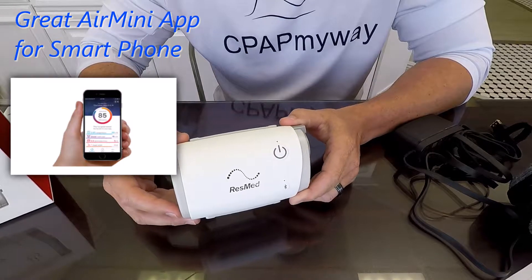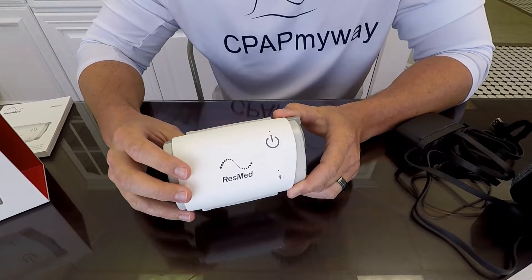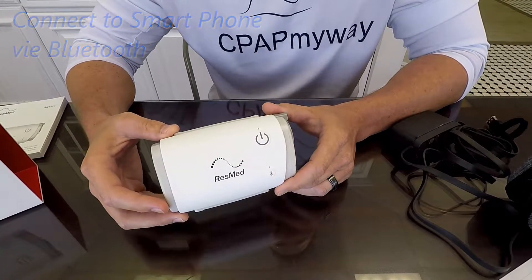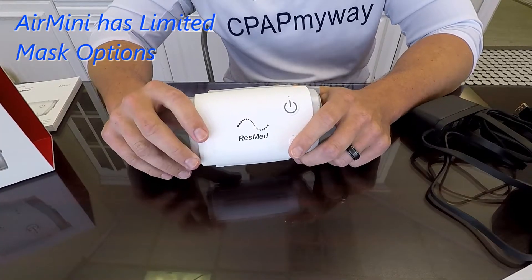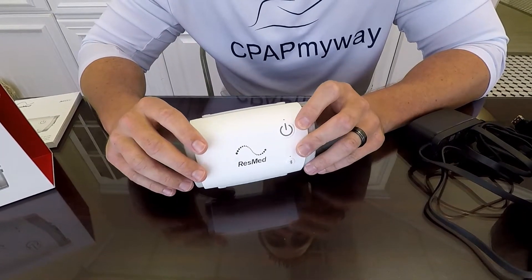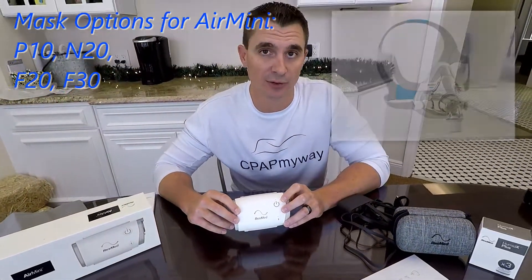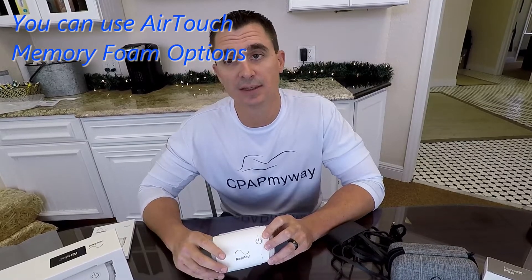It also has a really nice app, the Air Mini app — not to be confused with the My Air app. The Air Mini app is specific to the Air Mini and does a really good job of sending your daily reports and will Bluetooth to your unit for direct connectivity. The cons are the mask limitations. You can only use one of four ResMed masks: the P10, the N20, the F20, or the F30. That also includes the Air Touch F20 and the Air Touch N20, so technically six masks, but you are limited to those — no off-brand or opposing brands at all.